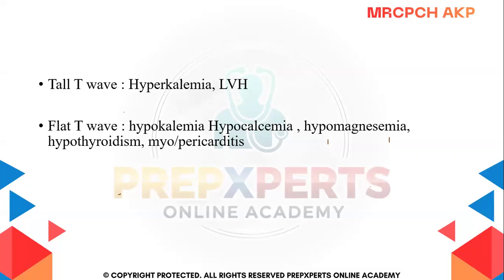Just memorize that tall T waves are due to hyperkalemia and left ventricular hypertrophy, and flat T waves are due to hypokalemia, hypocalcemia, hypomagnesemia, and also hypothyroidism. In cases of inflammation in the heart, like myocarditis and pericarditis, we are going to get flat T waves.